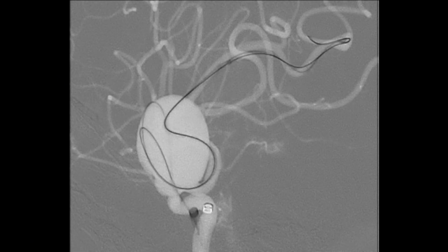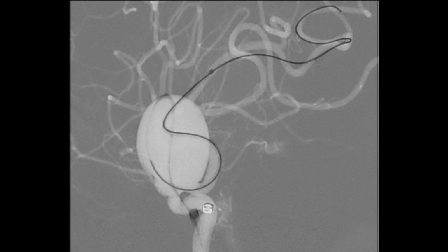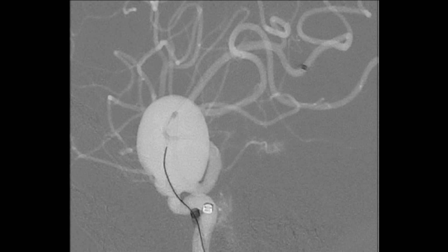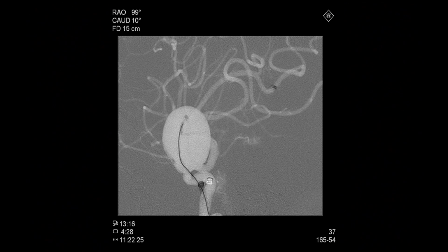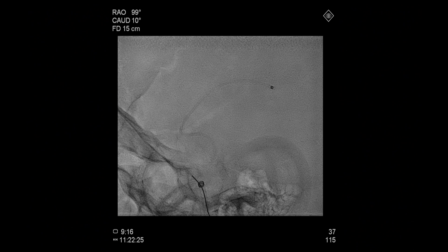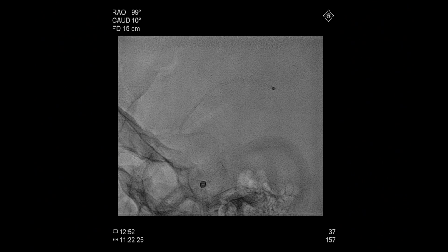Attempt was made to straighten it. It wasn't possible. So we again took it distally, brought the wire into the Marksman, and then straightened it. This is static imaging showing the steps. The wire tip at the loop of the catheter. You can see the arrow, and then with a torque it was pulled out, straightening the microcatheter. This helped us to avoid the exchange.